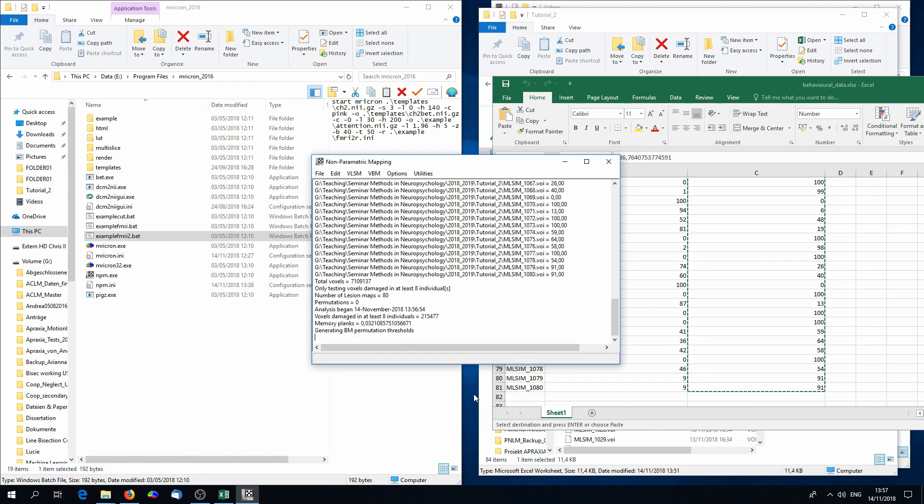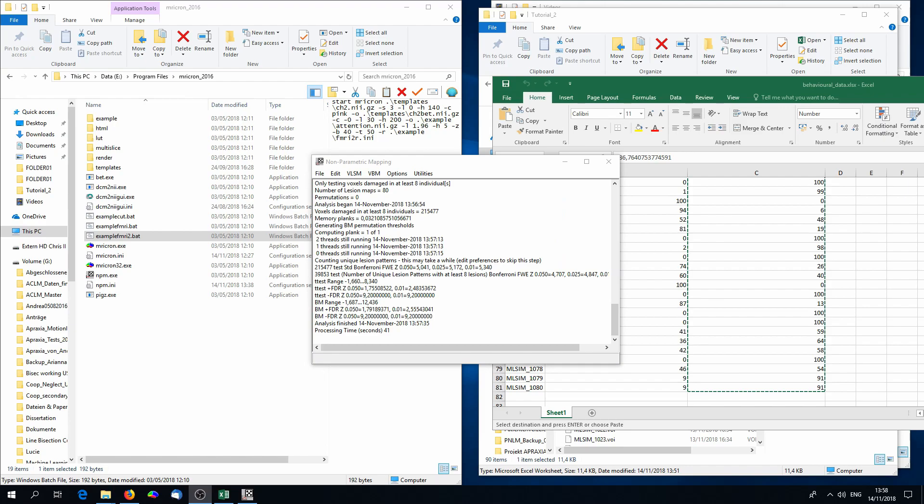This can take a few seconds or minutes. And after some time, the GUI will tell you that the analysis has been finished.